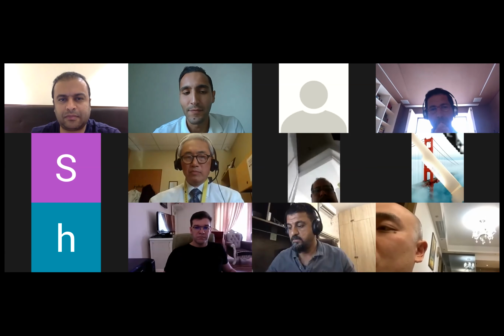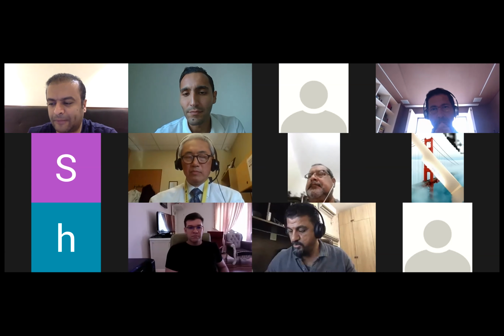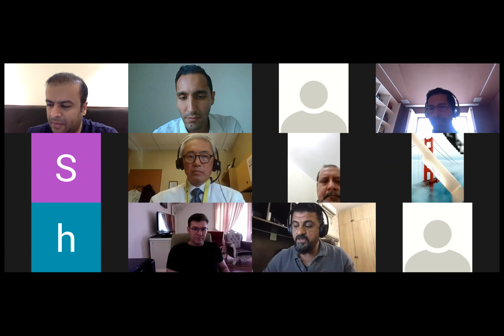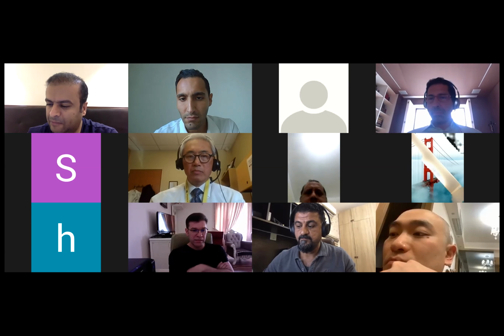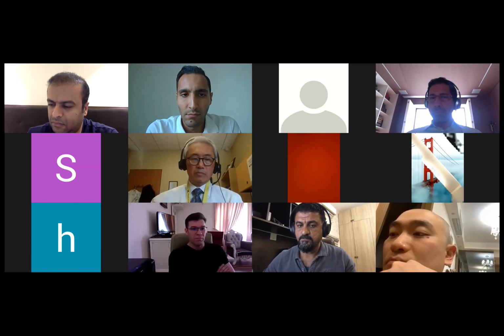Dr. Muzahim, I have many questions and I'm trying to summarize them. The first question they're asking you: why stand-alone cage? Yes, this is a debatable issue, Ghazwan. There are a lot of papers published in this regard. Why stand-alone? Why not plate? I summarized in the talk: why a plate? More cost, more time, possible dysphagia.